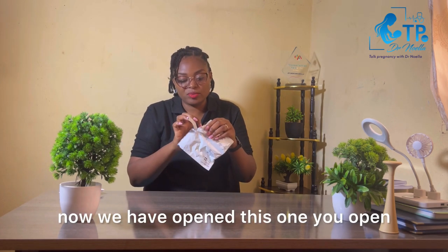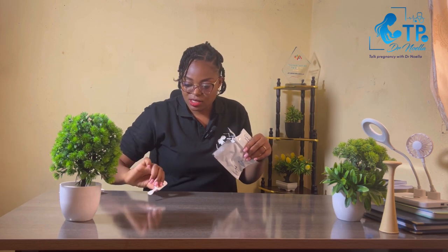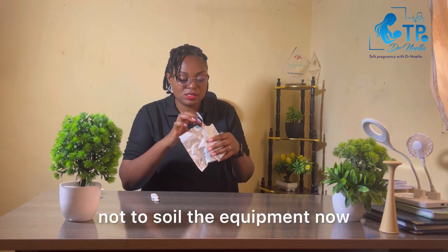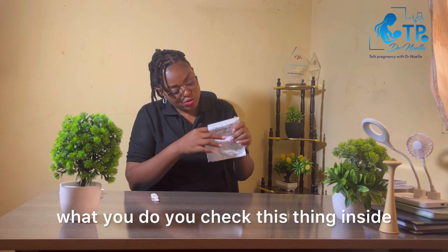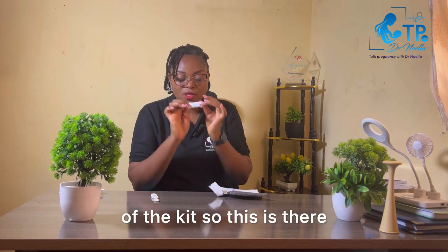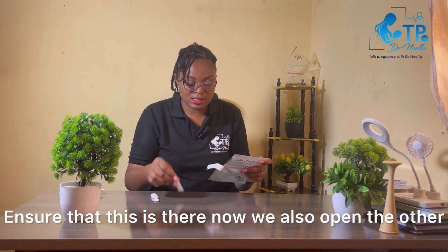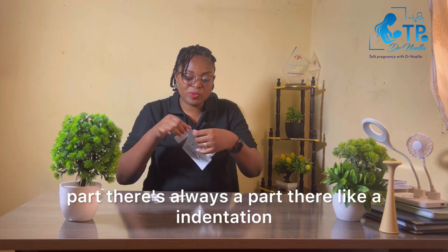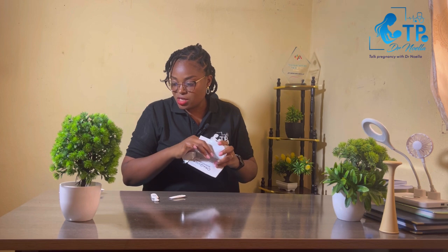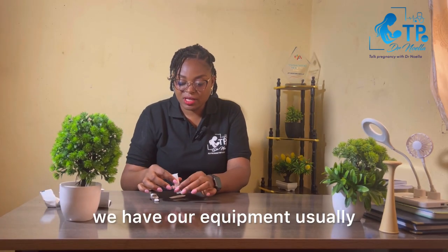Once you've opened the kit, you have your collection spatula. Place it on a clean surface and ensure that you have washed your hands carefully so as not to contaminate the equipment. You check that the safety seal inside is there — that ensures the safety of the kit. Then open the other part as well; there's always an indentation for you to strip it off. Once you have opened both parts, these are all your equipment.